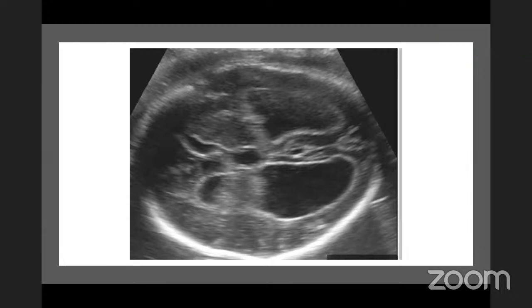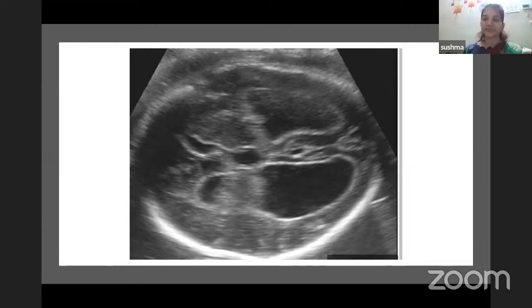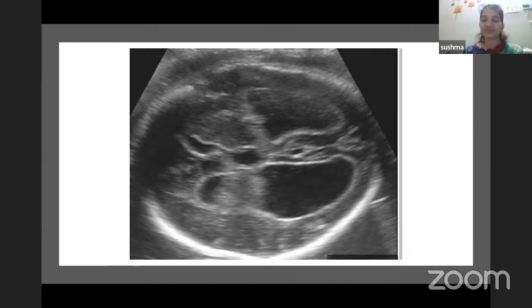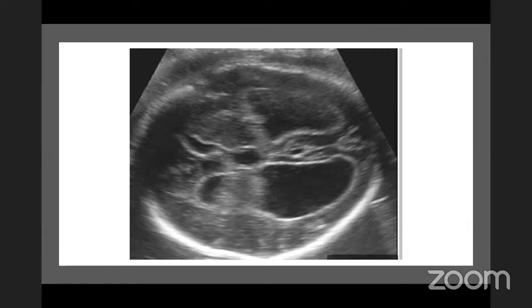Ma'am, we have a few more answers. Yeah, please. By Dr. Upma Yadav, ventriculomegaly. And Dr. Aruna Sallu, ventriculomegaly. And Dr. Alka Patil, tear-shaped lateral ventricle, absent CSP.